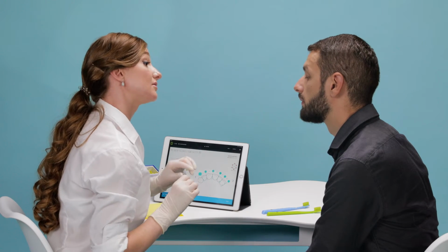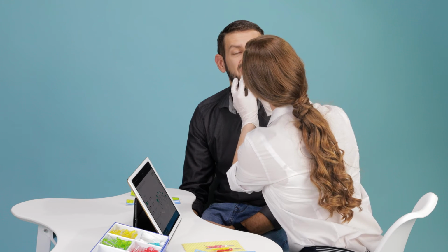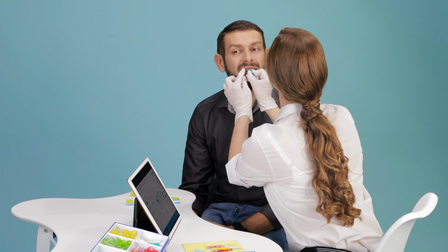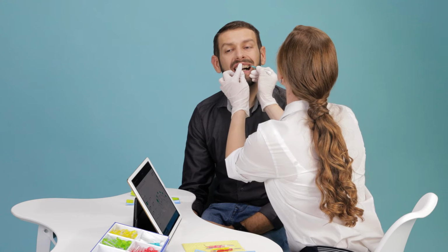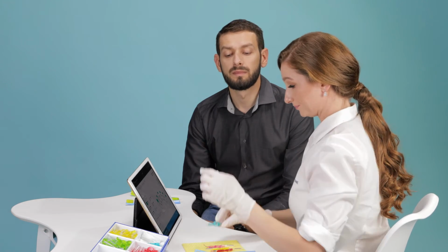I continue on to the upper anterior sextant and check the colours from the IAP are a correct match with the turquoise brush. No changes are required, so I continue on to the upper left sextant.